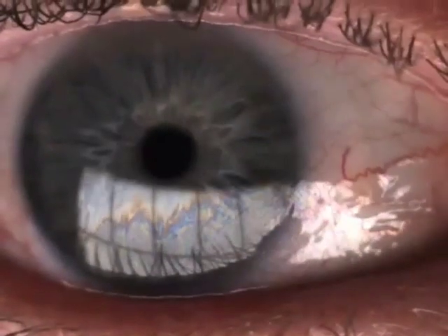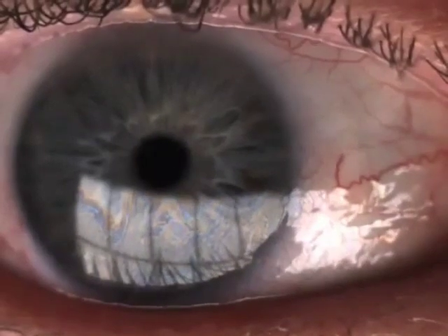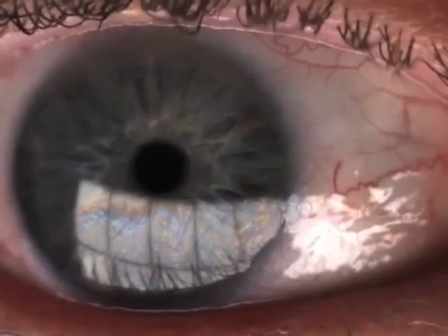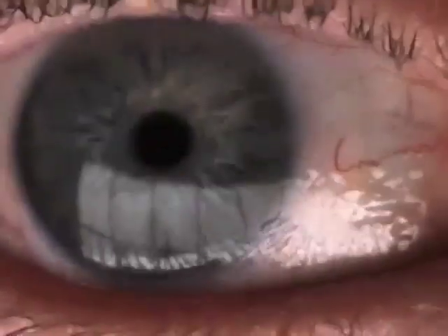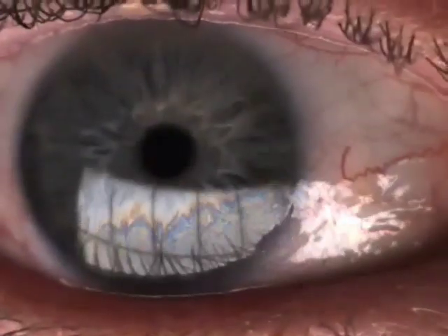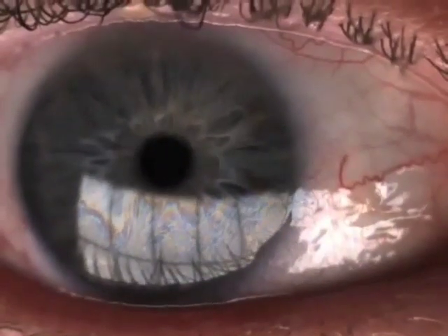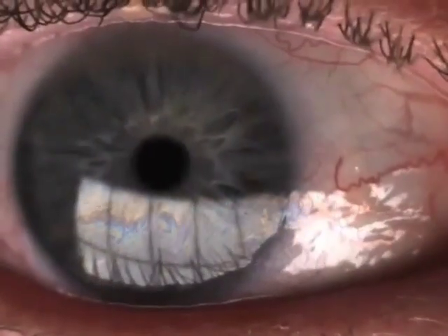In this video, the brown and blue colors you see moving from the lower lid up towards the top of the screen are representing the oily portion of the tear film. The color indicates the thickness of that oily portion of the tear film. And this is a normal tear film showing adequate thickness of the oily portion.